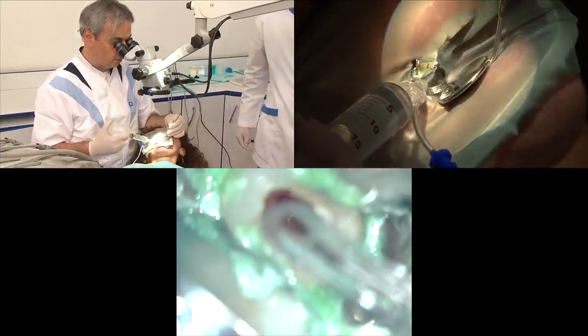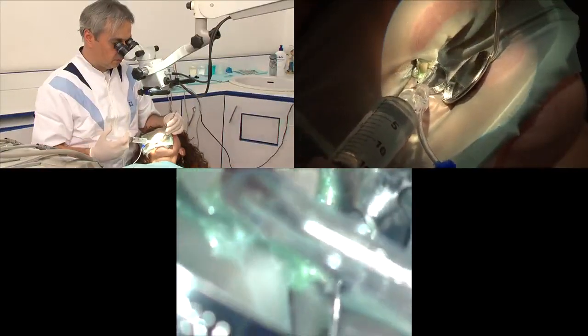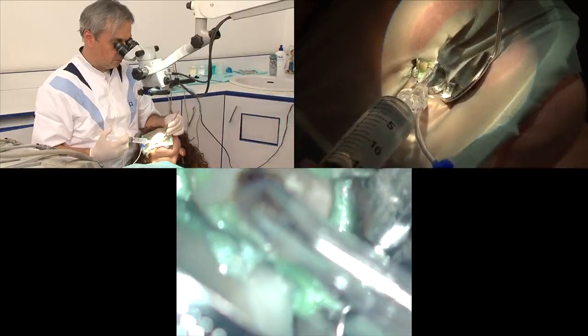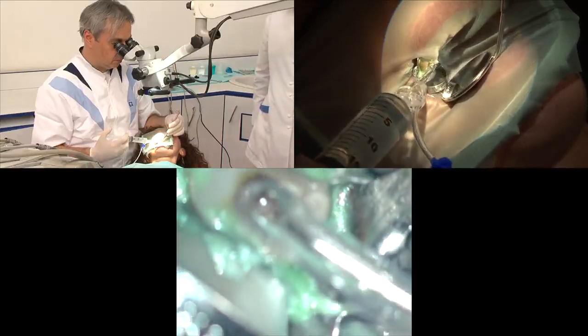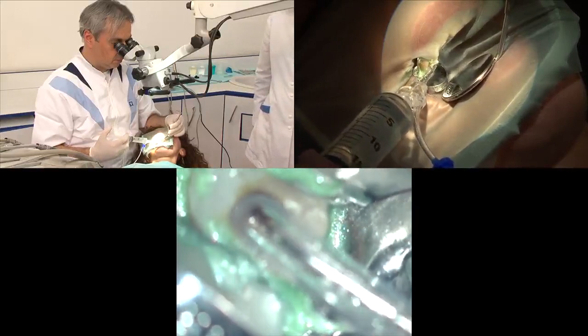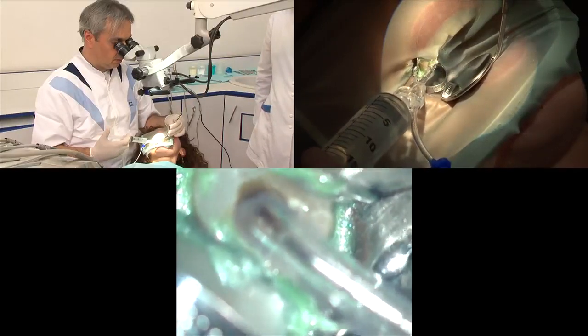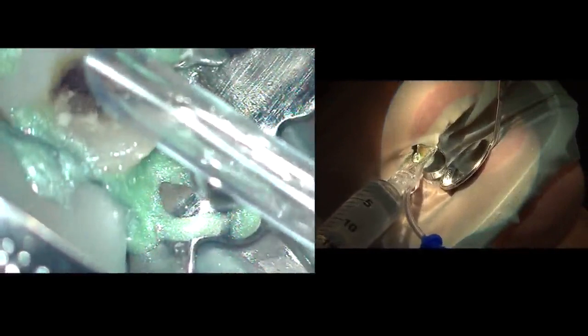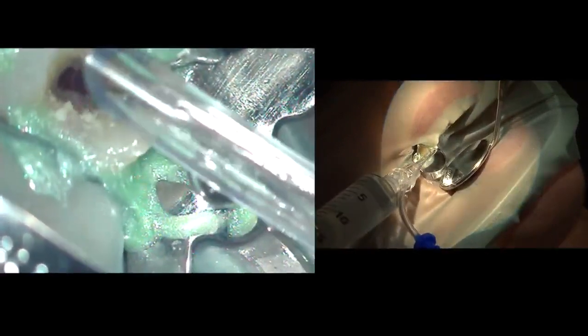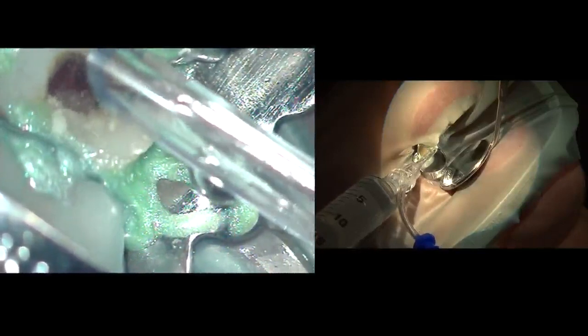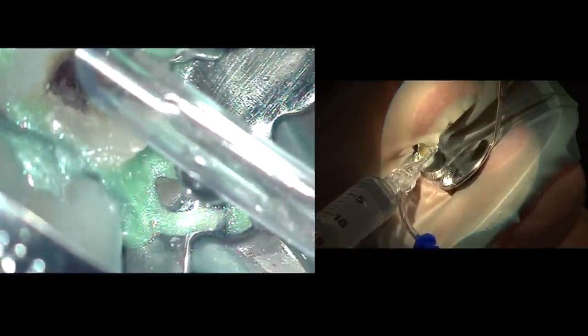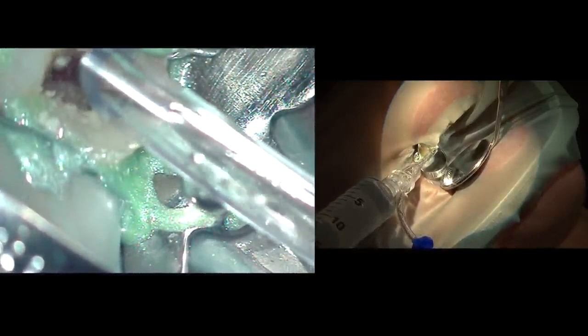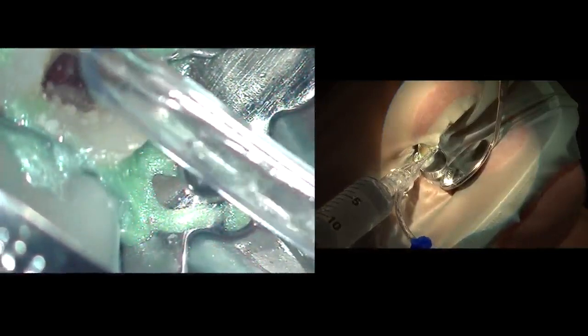The first step after opening the access cavity and finding the roots is to take the Indovac and to take all the debris to wash them out from the main access cavity. The tip of the master delivery unit must be angulated towards the walls of the access cavity. You can see here the flow of the irrigants coming out from the access cavity. Sodium hypochlorite is being delivered and then taking out.